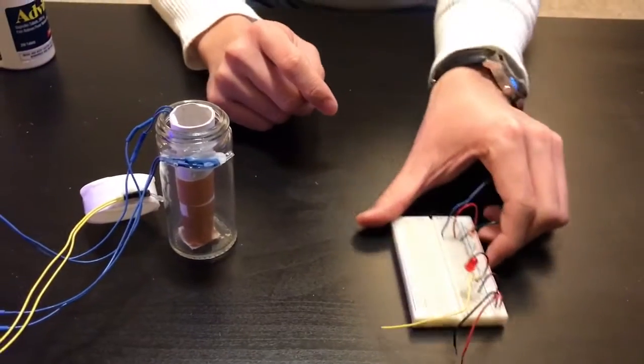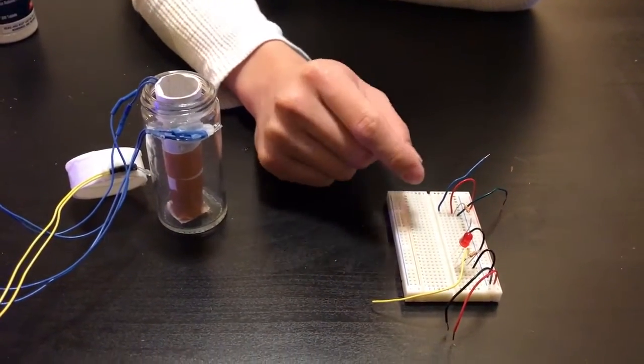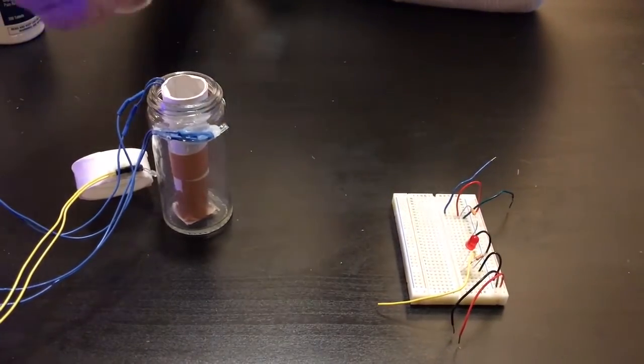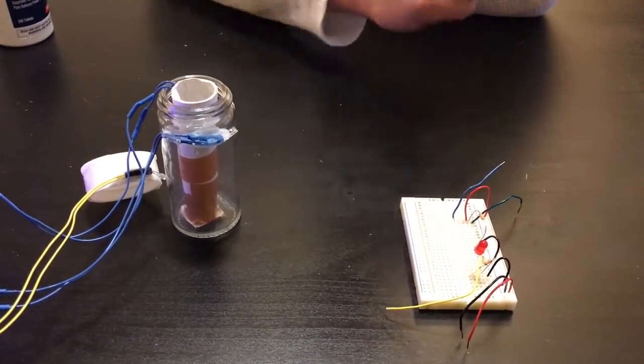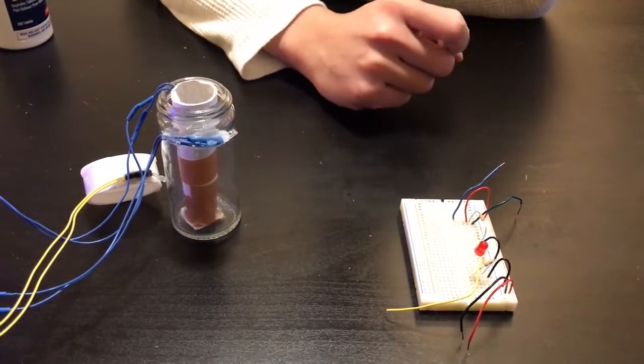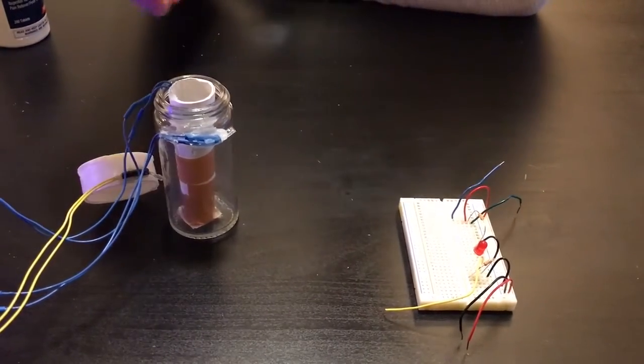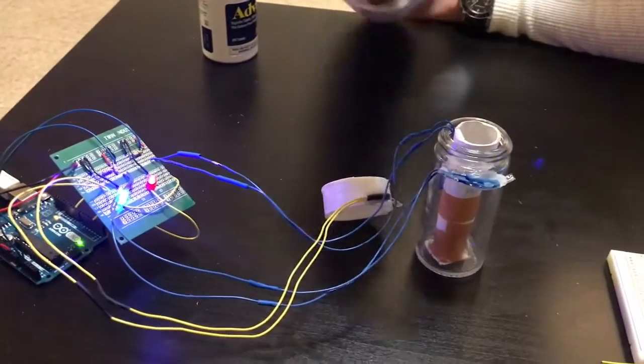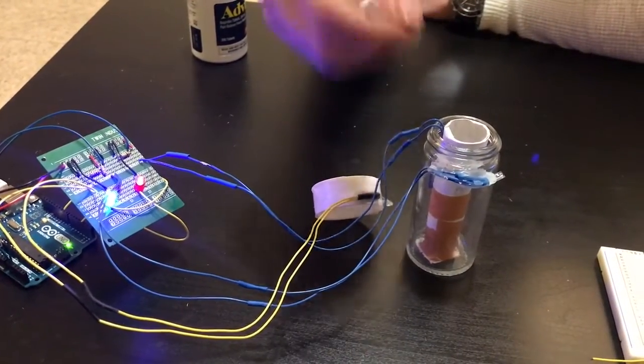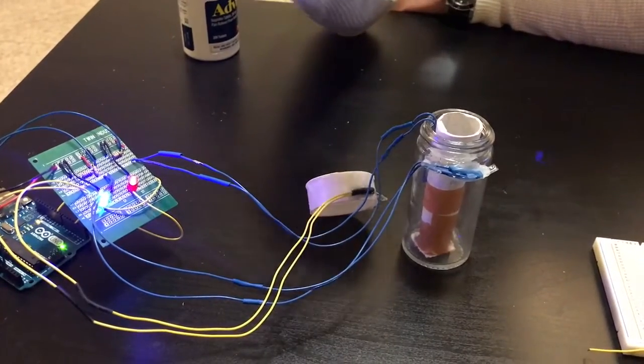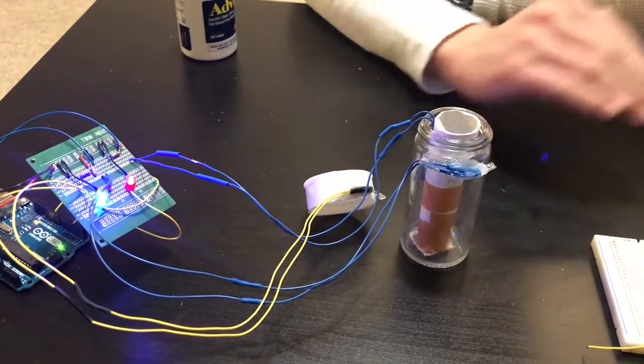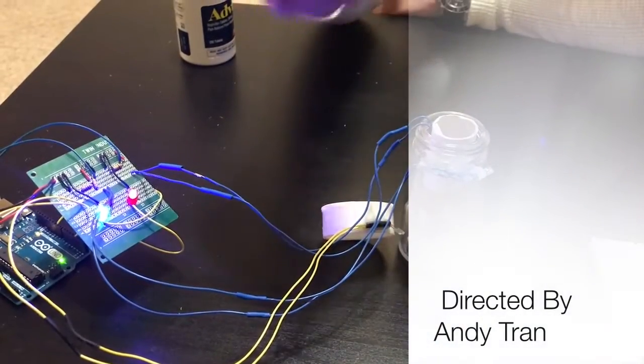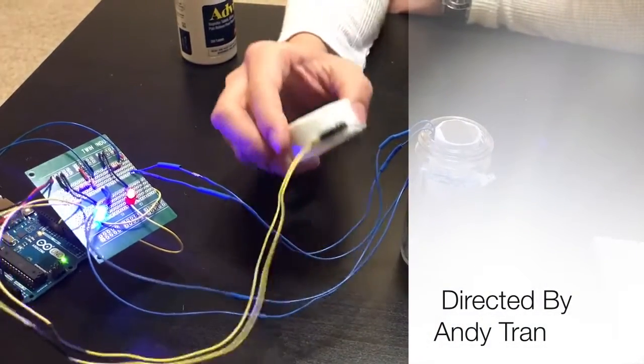For our second component the pressure sensitive resistor we also mapped the pressure sensor weight values onto analog values from 0 to 1023. Each time we put a weight in we empirically tested the analog weight value change that each pill has caused and we set the appropriate threshold so that whenever we put a new weight in we're able to detect how many pills are in the bottle.